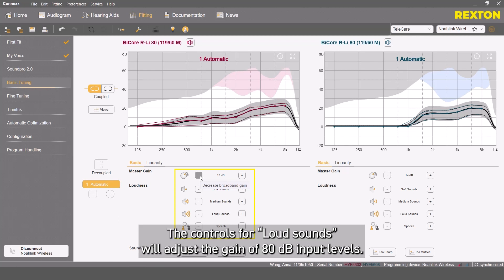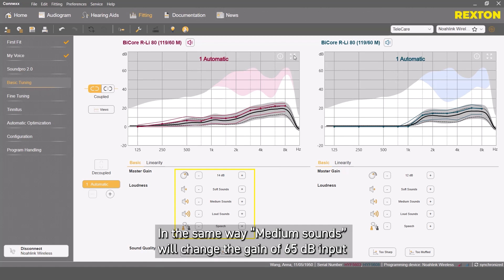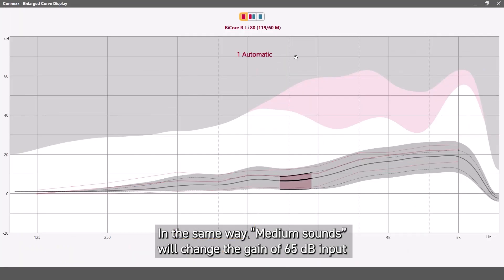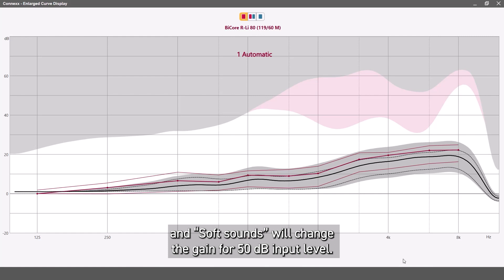The controls for loud sounds will adjust the gain of 80 dB input levels. In the same way, medium sounds will change the gain of 65 dB input, and soft sounds will change the gain for 50 dB input level.